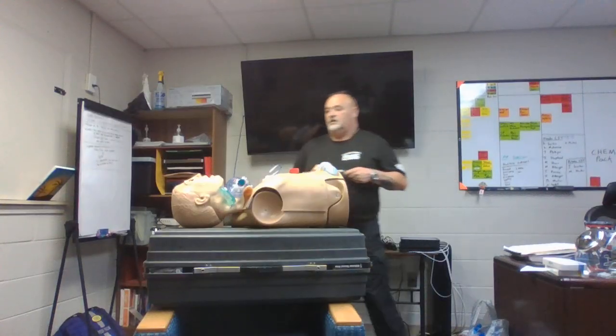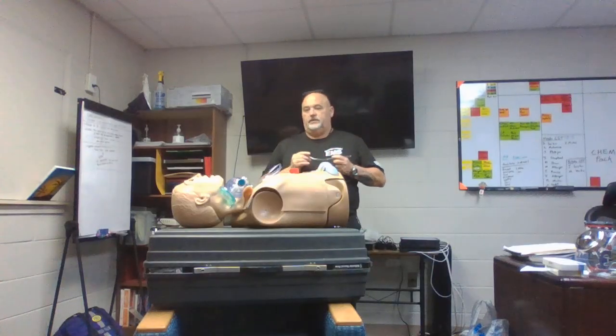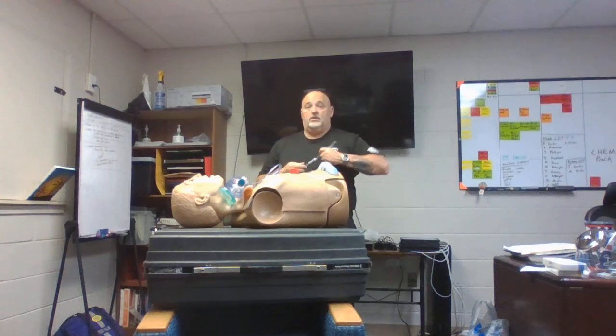If they're unresponsive and there's no trauma, no spinal issues, roll that patient, suction out. What you don't want is all that emesis staying in there, right? You're going to try to bag. You're going to force all that down into where? The lungs. So then we're going to have issues trying to ventilate that patient, because you can move air down in that airway, but you can't oxygenate them. So that could be a massive problem. We want to avoid that.